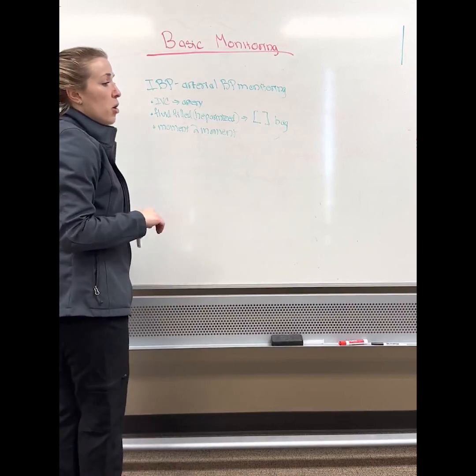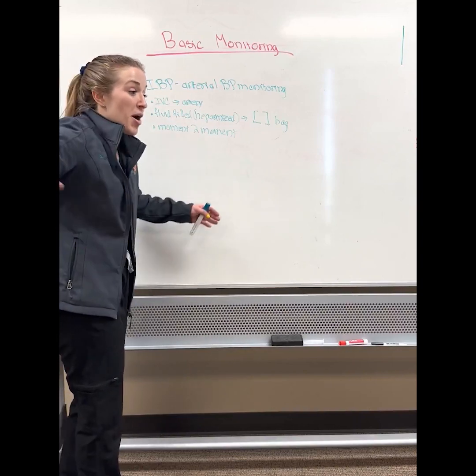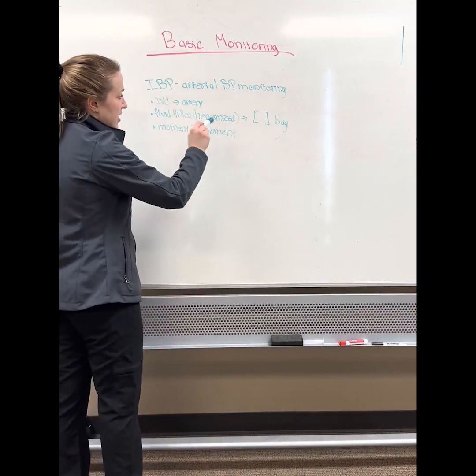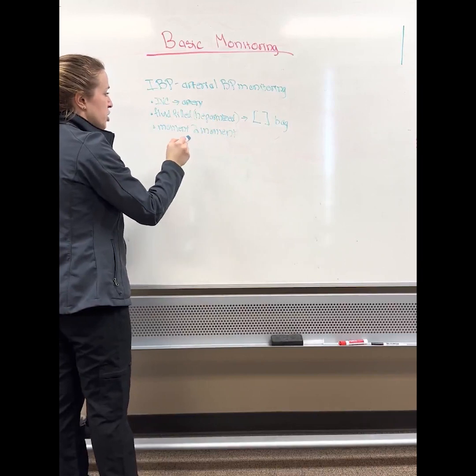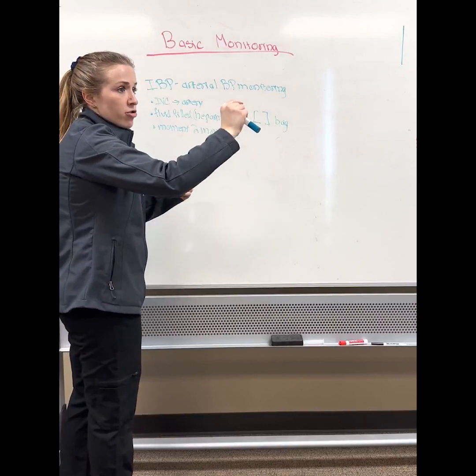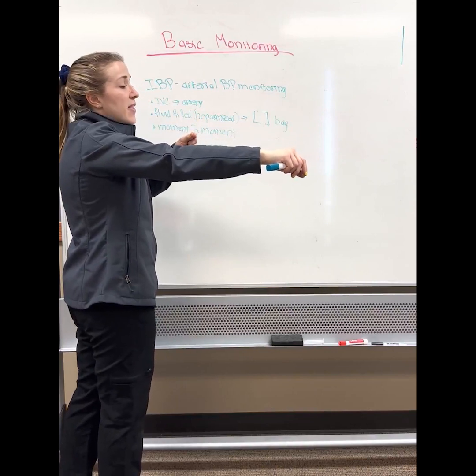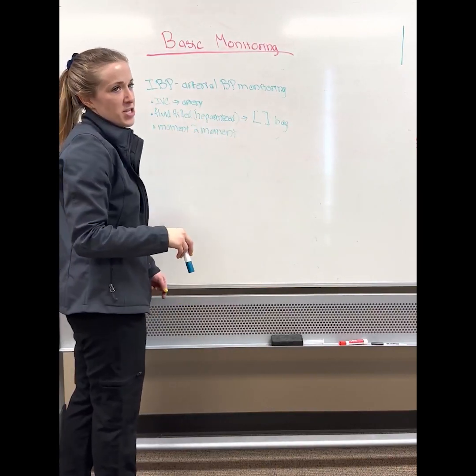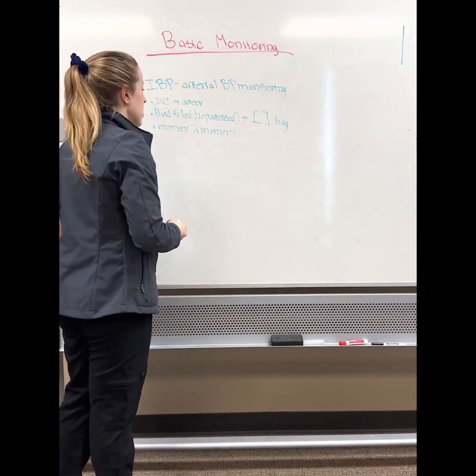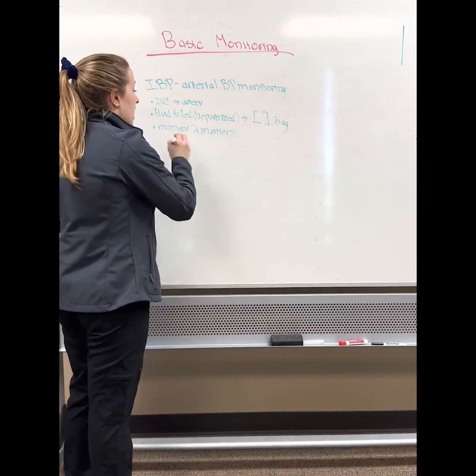The catheter is in the artery, and it picks up the pressure waveform from the contraction of the heart that was spread all the way down the arterial tree. That energy travels in fluid-filled tubing from the artery to a transducer, where the signal is converted to an electrical signal, and then it displays the systolic, mean, and diastolic blood pressure. Because it's in an artery and reading each heartbeat as it happens, invasive blood pressure monitoring is the most accurate measurement you can do, and it's moment to moment.